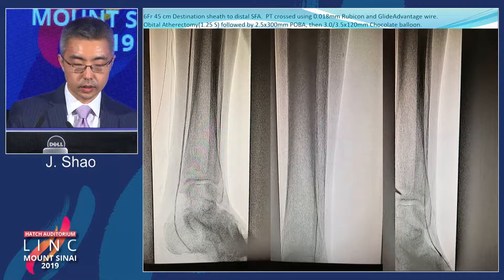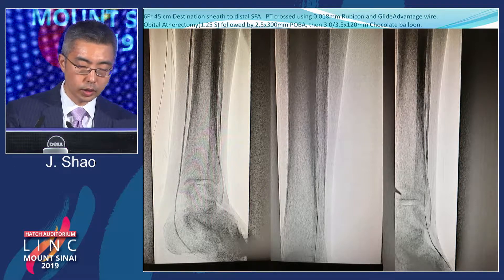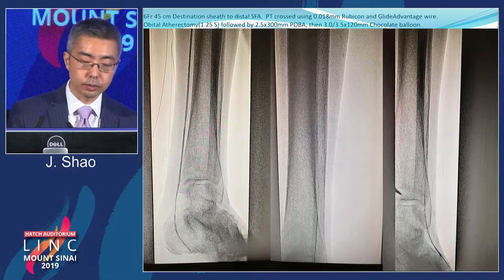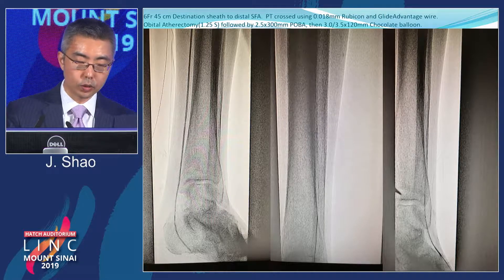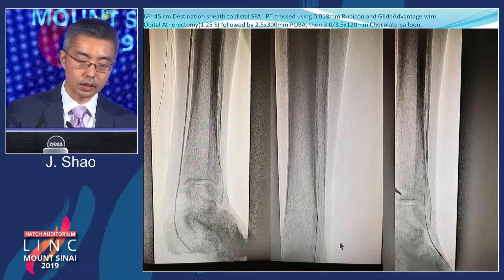With a 6-French destination sheath in the distal SFA using an OTW crossing catheter and wires, I was able to cross the entire PT occlusion without getting retrograde access. The wire went into the plantar arch and almost retrograde up the pedal loop. I went ahead with orbital atherectomy, plain old balloon, then chased it with chocolate balloon at 30 and 35 approximately. Once the PT was fixed, with the wire already through the pedal loop, I used ultrasound to access the DP retrograde.